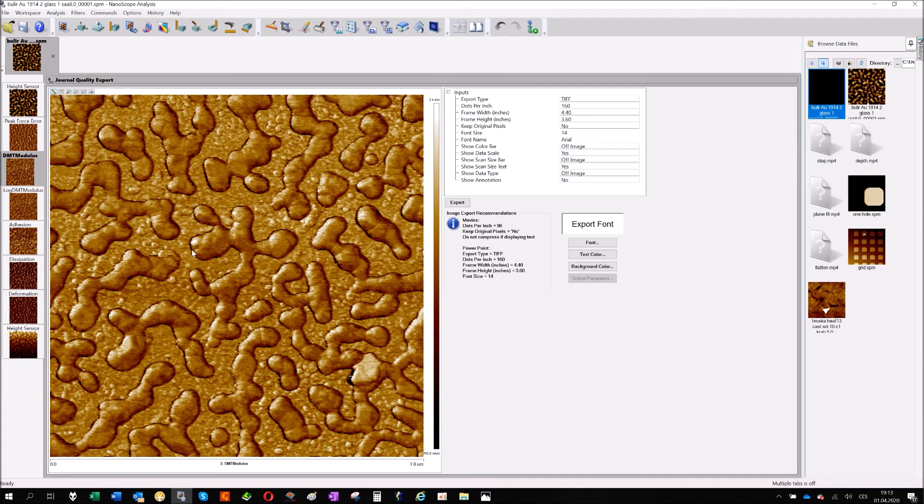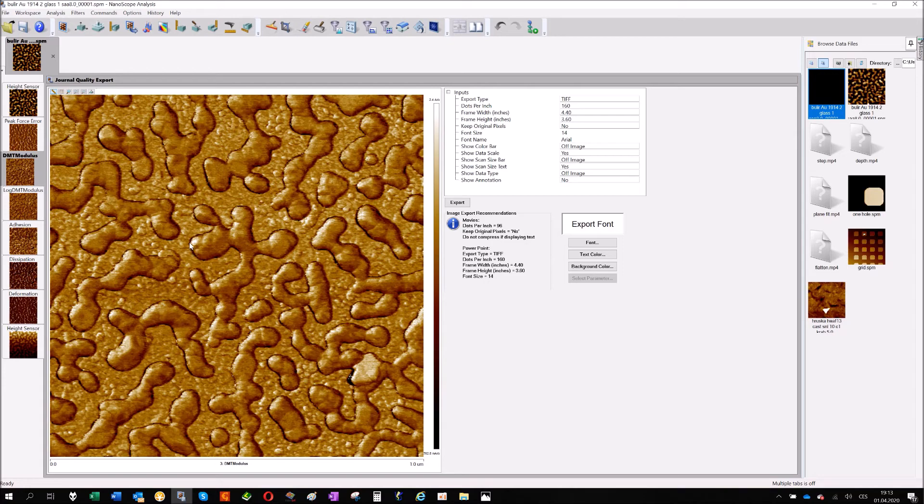There's a different area, different color. That's because you have a different area of contact, so it's reasonable that you have a change in your modulus, an elastic modulus calculated by DMT model.